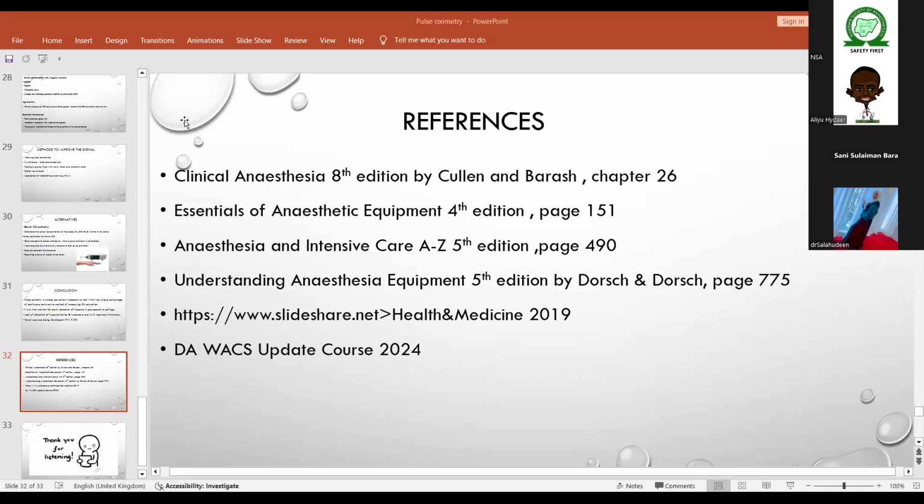Though it can only show us the gas of life, it can't tell us if the tissues are metabolizing. Like end-tidal CO2 will tell us, okay, tissues are metabolizing, so this is the CO2. I think this is little I can respond. I have plenty teachers around that can add to it. Thank you.